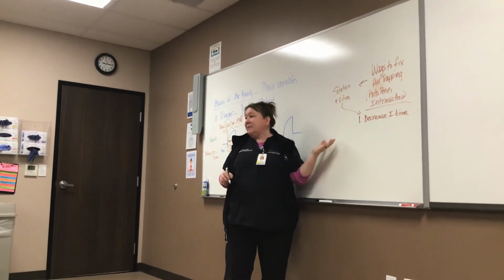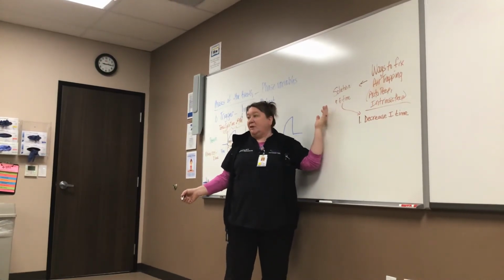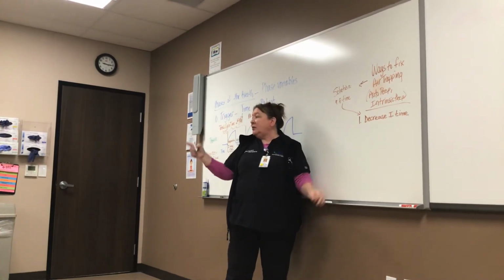Now, if a question comes up that says, what do you have to do to correct air trapping? And one of the answers is make your expiratory time longer, then that's just a concept check and that would be right. But if it's actually making changes, that's not a change you can make.